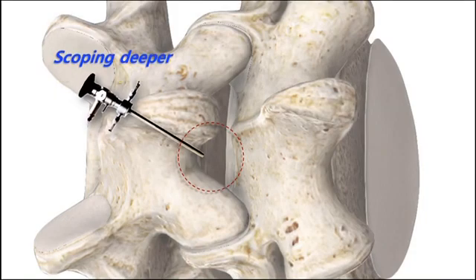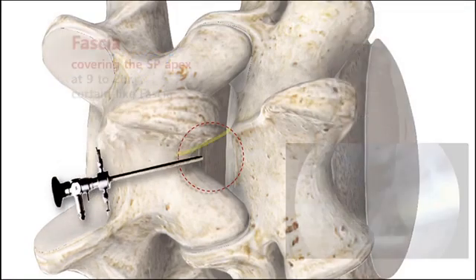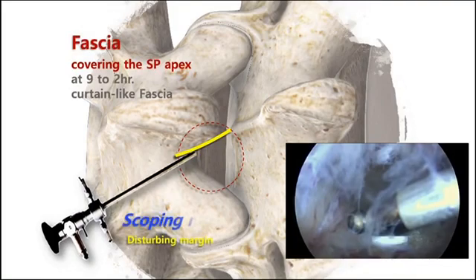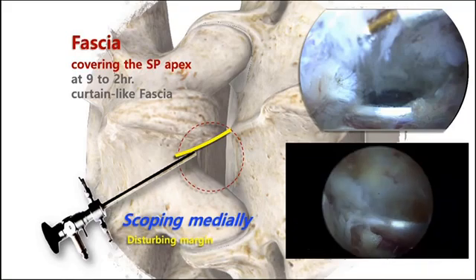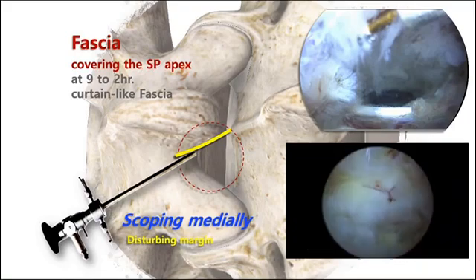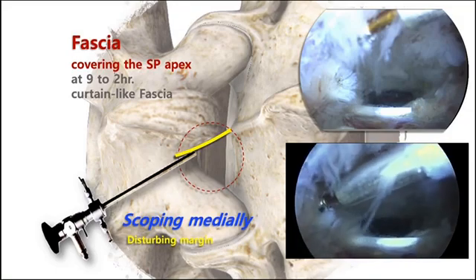When you put an endoscope deeper, there can be no disturbing structures and you can see deeply located structures easily. However, when you lift up the scope upper and dorsally to see the contralateral side structure — the SP base — the subcutaneous fascia always runs down and covers your endoscopic view.